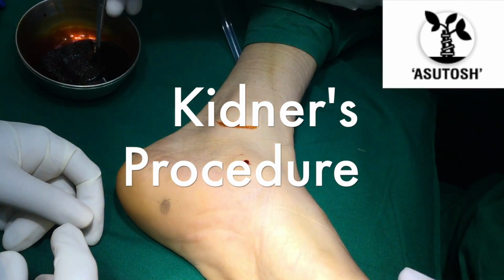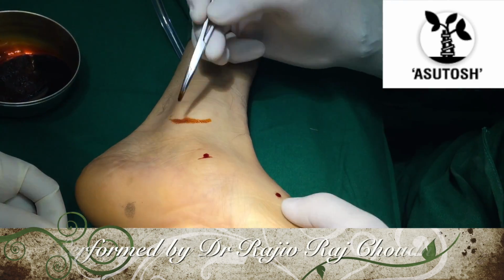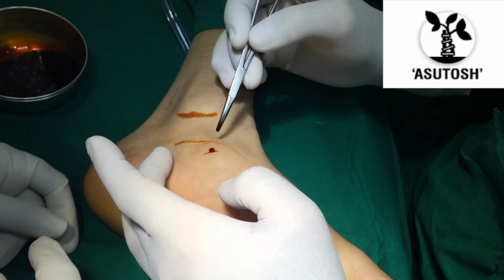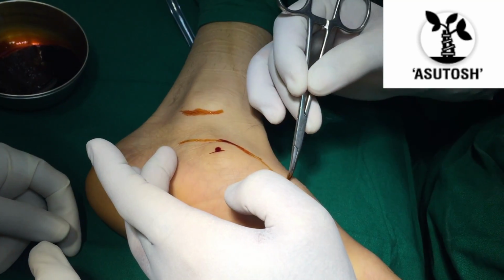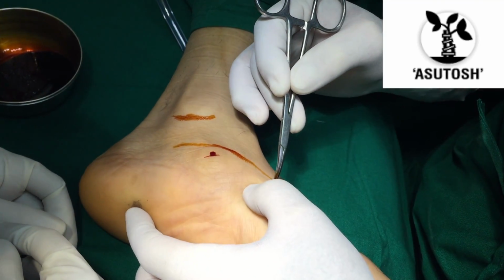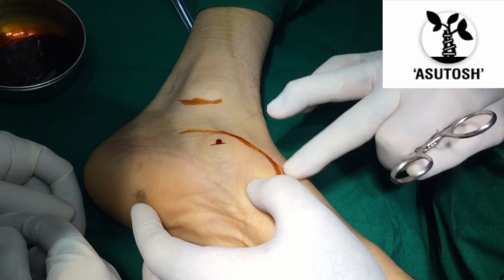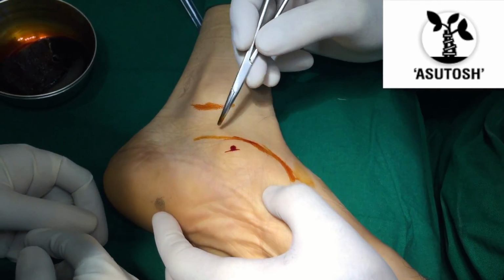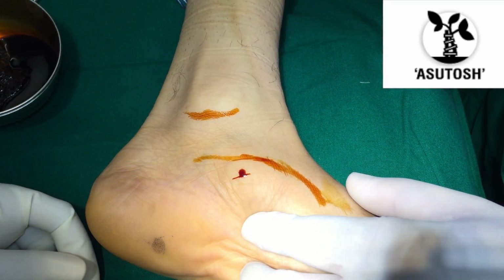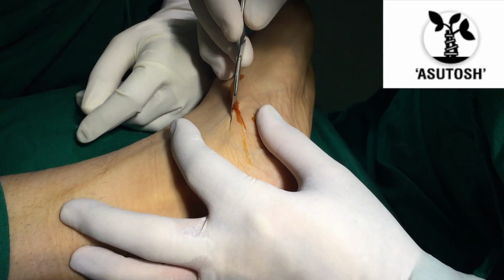Coming to the live surgery that we are performing in our OT, this is a Kidner's procedure with a posterior tibial tendon advancement. We are marking the incision. We can see the medial malleolus being marked with betadine, and the arc of the foot is being marked right now with a mosquito. The point that we can see is the navicular. So basically our incision would be in line with the arc of the foot the patient has.